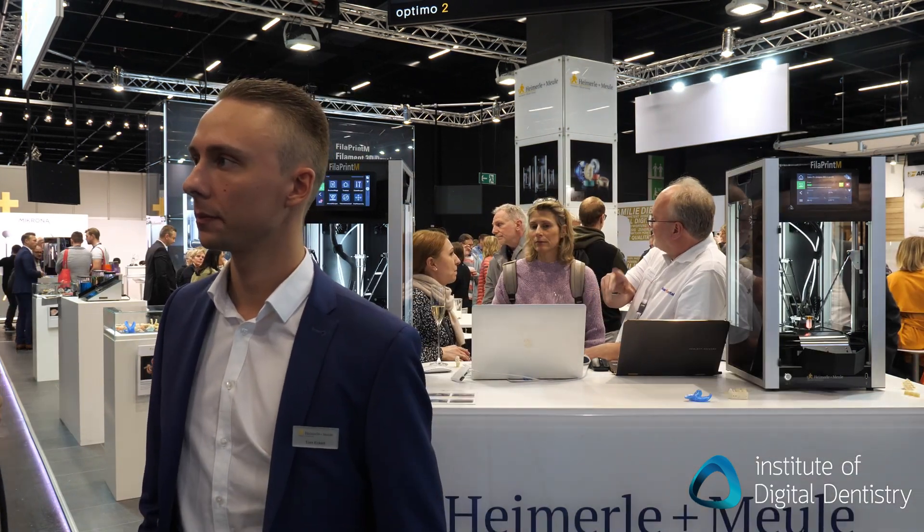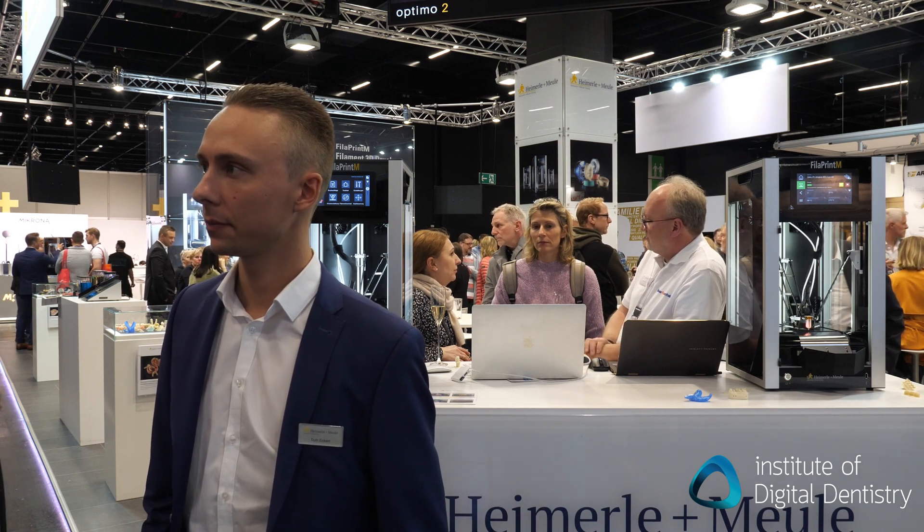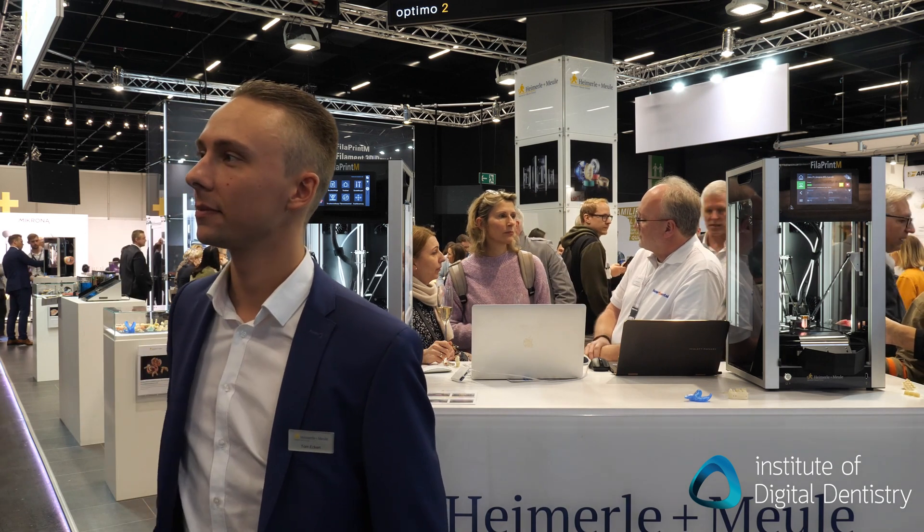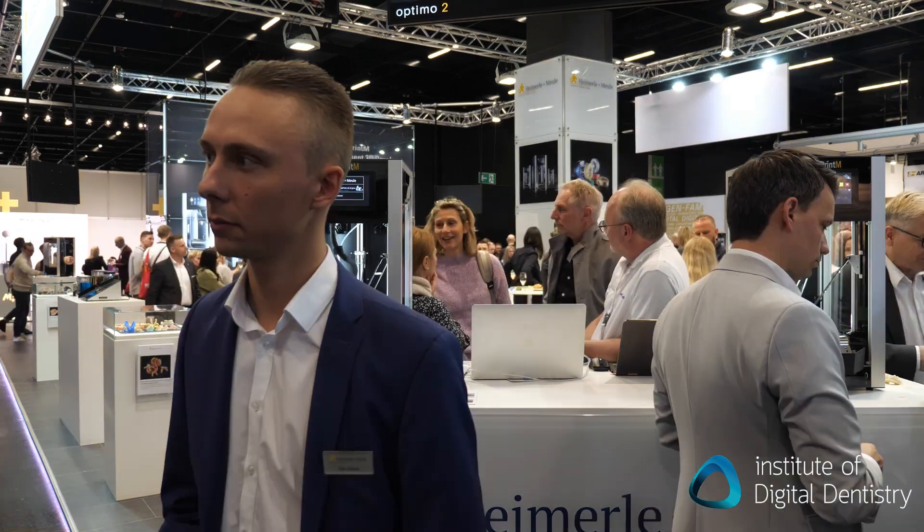So where in the world can we currently get this printer? Now you can only buy it in Germany, and in the next month we will sell it in Europe. I think in the next year we are looking for distributors to sell our printer abroad. If you're interested in this innovative filament printer, get in touch. Thanks for your time. No problem, you're welcome.